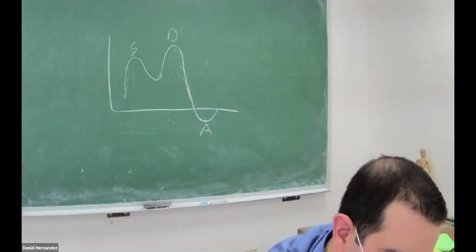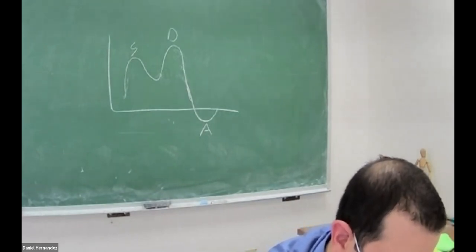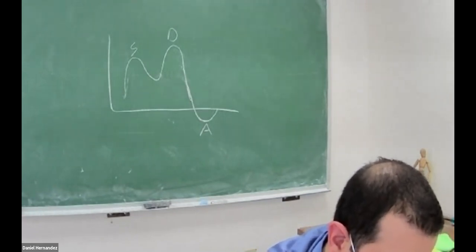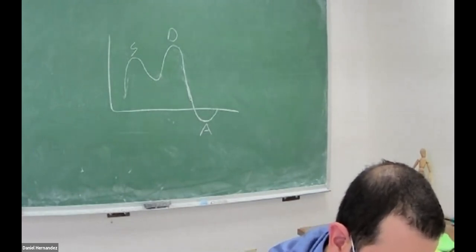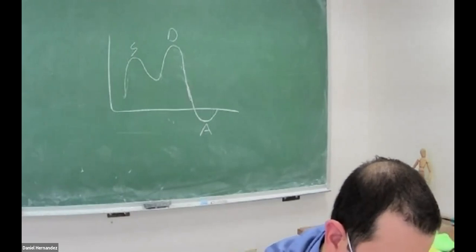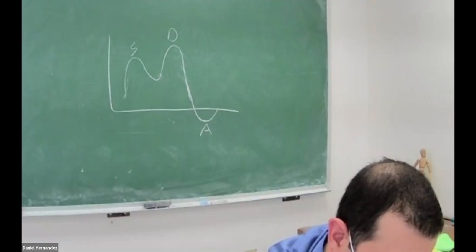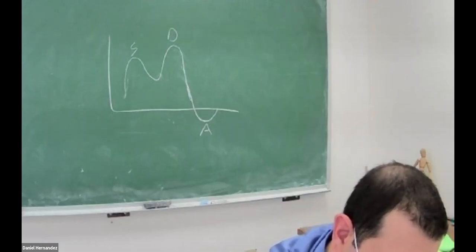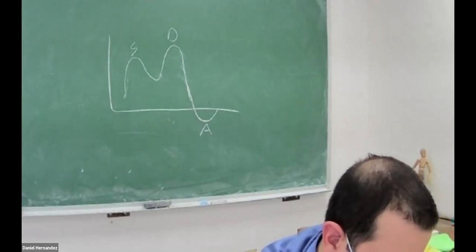Which of the following echocardiographic findings would be associated with aortic dissection? An aortic valve area of 1 centimeter squared, a left ventricular outflow tract diameter of 1.8 centimeters, a left ventricular wall measurement of 5 millimeters, or wall motion abnormalities associated with obstruction of the right coronary artery territory, or aortic stenosis.